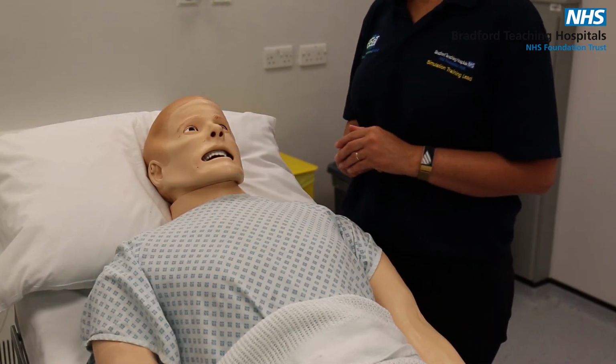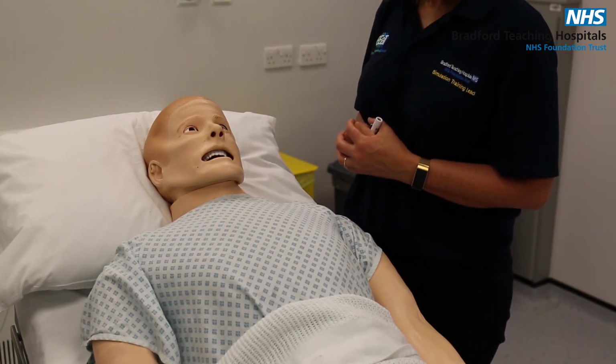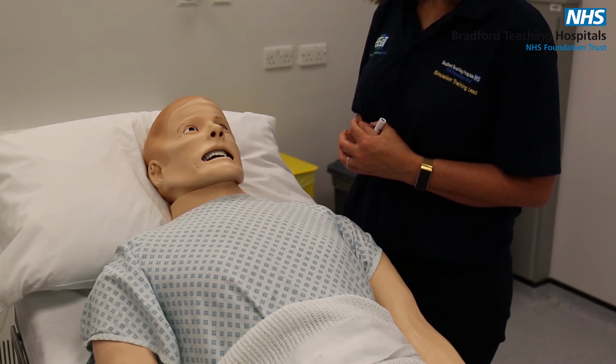So Simman can also speak to us as well. So hello Simman, how are you today? Hello, I'm fine, thank you.